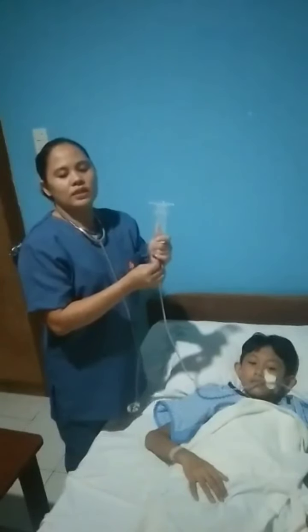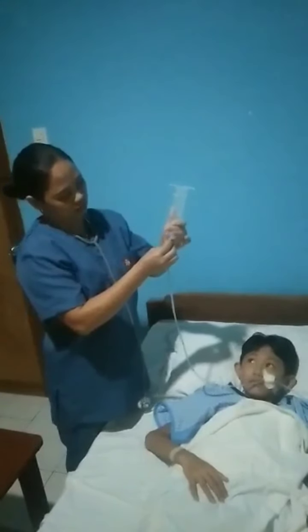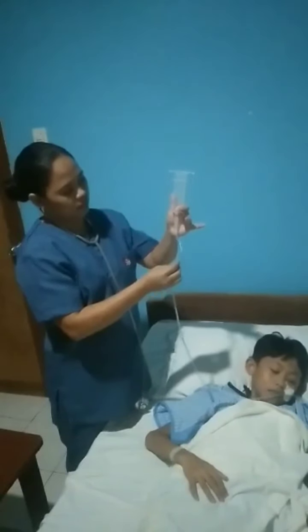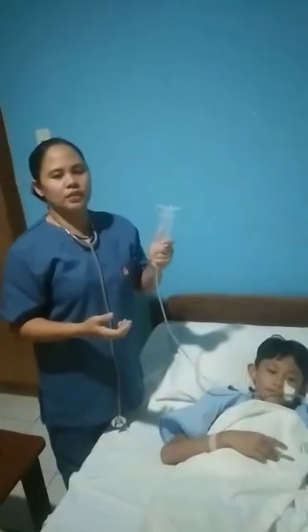And slowly let go of the kink and let the gravity carry the water inside the tube. And kink it back. Let the water fall at the end of the septosyringe, since it will carry air and cause distension. After flushing, we can now proceed with our feeding.